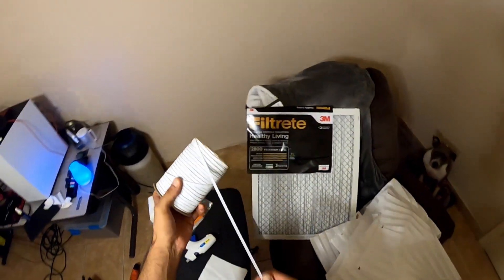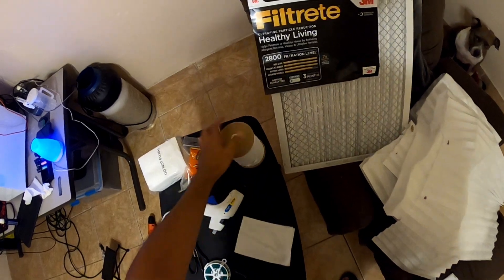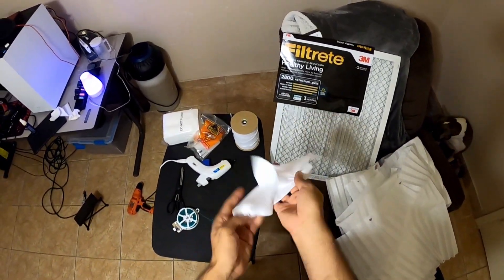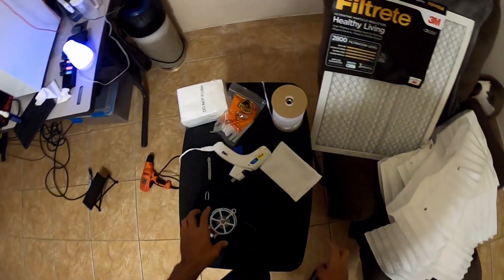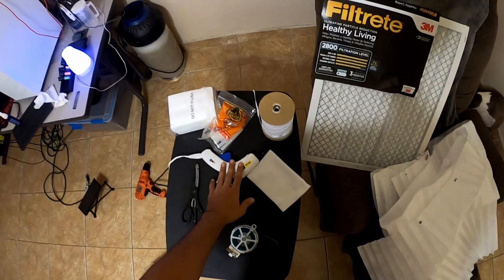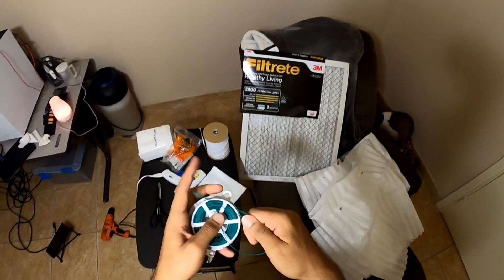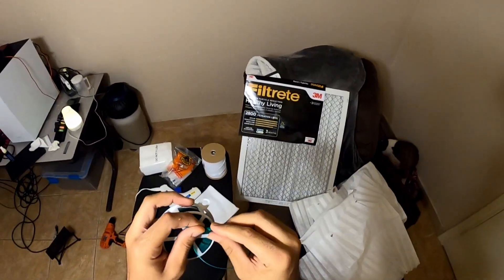Then we got some elastic band to make the bands that attach to your ears. We got some dry wipes to add as another layer of protection. And then a glue gun, some scissors. And I got this twine online as well — I'm going to use this to form the structure for the bridge of the nose and the face.